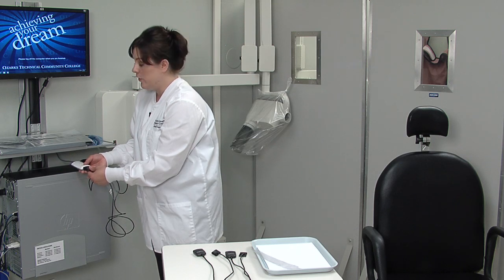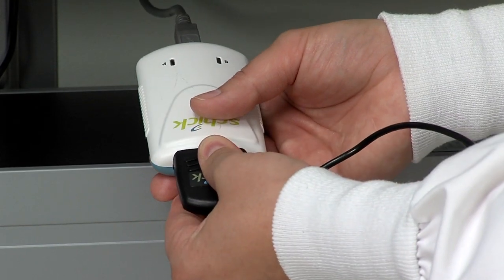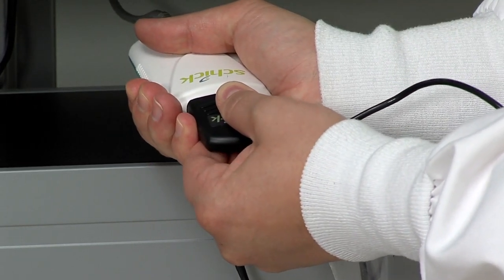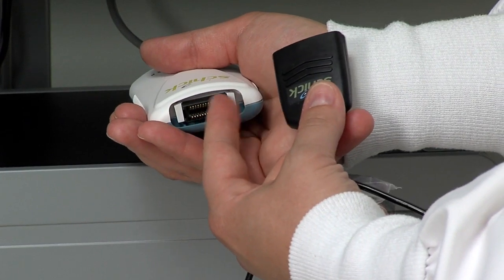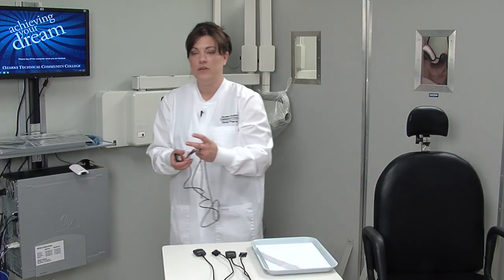When you are ready to detach this from the remote, you want to grasp it here on the front and attempt to pull it out as straight as possible. Again, it is a tight fit, but excessive wiggling back and forth will eventually damage the prongs inside the remote. And that is a brief introduction to the Schick CDR digital sensor.